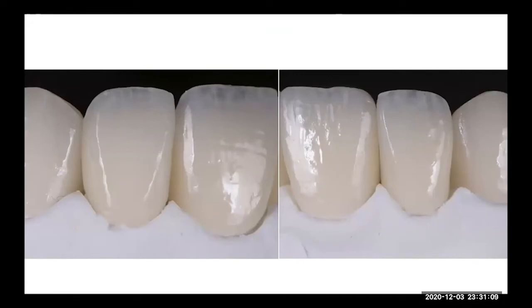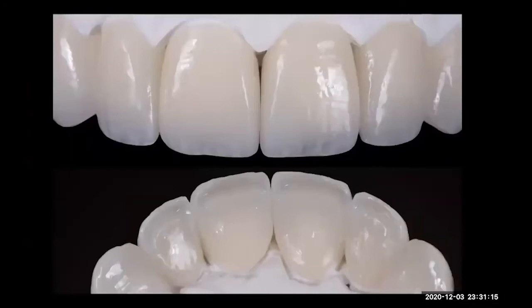So we can take the carver and go from the palatal side, and you can leave a nice surface. And then when you press, the material is really easy to organize and follow, it has a good copy of anatomy and everything. It's really nice. So you can see the translucency.